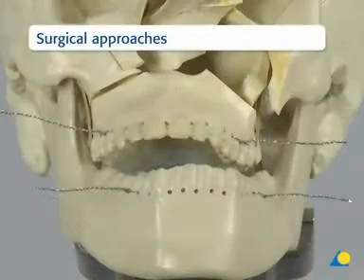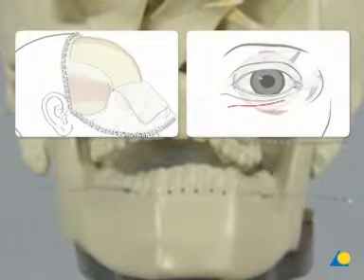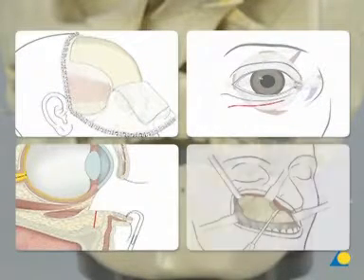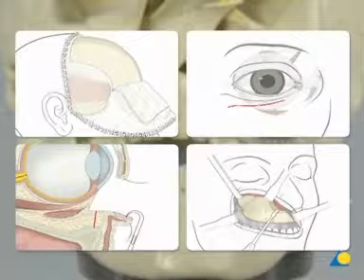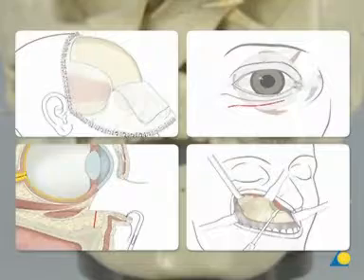Complex mid-face fractures can be approached with a combination of a coronal incision, a lower eyelid or trans-conjunctival incision, and a trans-oral upper buccal sulcus incision. If lacerations are present, they can also be used to access the underlying fractures.